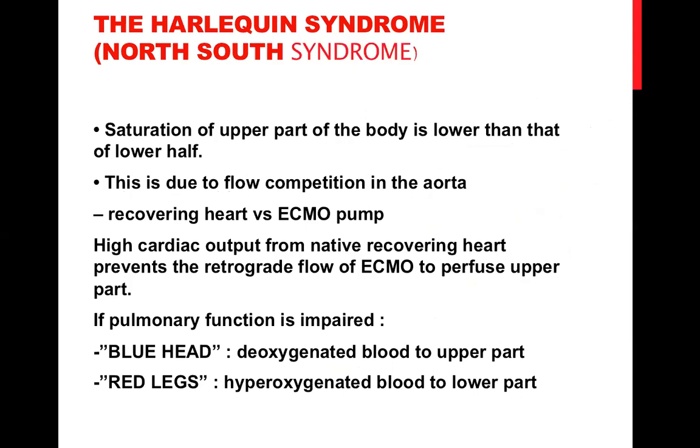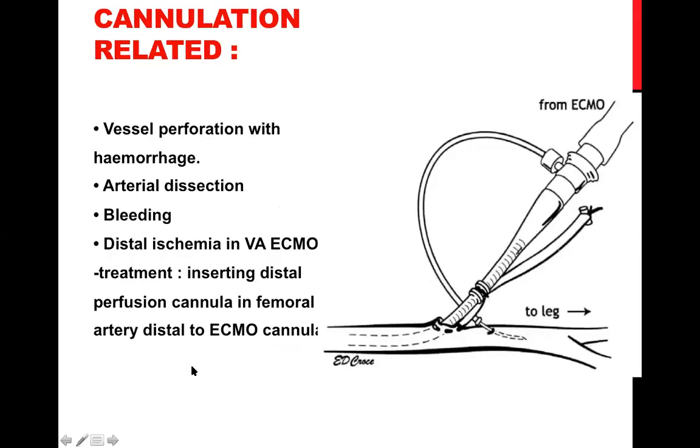So, kindly, I want to ask and clarify something with Dr. Faraz regarding post cardiotomy syndrome, post cardiac surgery. There are three schools for the site. If I need ECMO, one is to go central, keep it as it is, convert the cardiopulmonary bypass circuit to the ECMO circuit, keep the chest open, and close it later. The other approach is to keep it central but close the chest and bring the cannula through, like through the chest tube, but keep it central. The third option is to convert it to peripheral via femoral. What is preferred and when to use each?